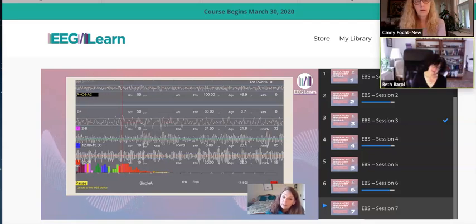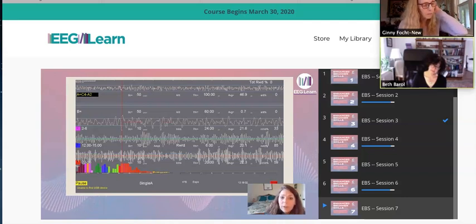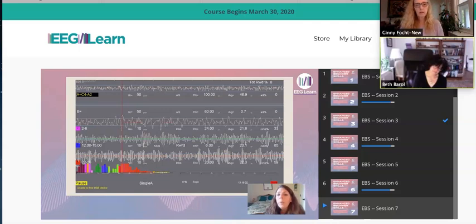So at least while they're in this neurofeedback yoga class, we want them to experiment with doing things using less energy, okay? So the things that make that fast frequency beta go up in amplitude would be trying really hard, tensing up, feeling frustrated.